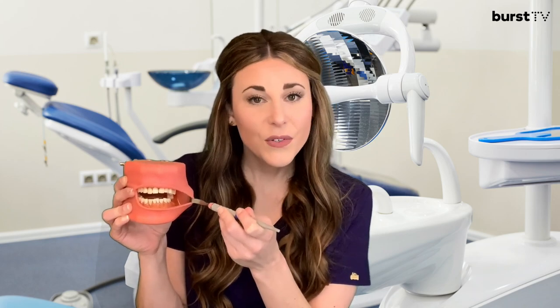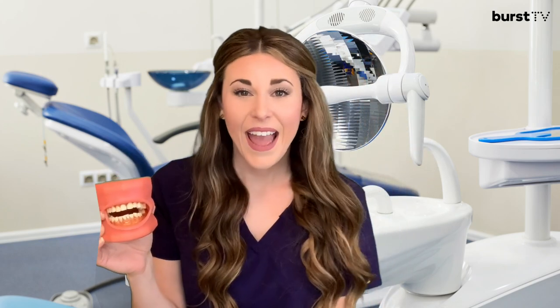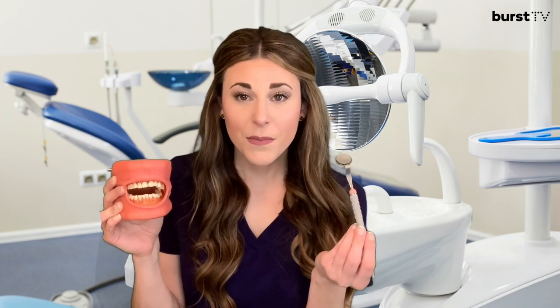By indirect vision, I mean that when we talk about the surfaces of teeth, we think of them as what we can see directly and indirectly. If I were to smile at you, you would directly be able to see the front side of my teeth, but you wouldn't be able to see the back side directly. Working like that would really hurt my neck over time, so we use the mouth mirror to see surfaces we wouldn't be able to see directly — we call that indirect vision.